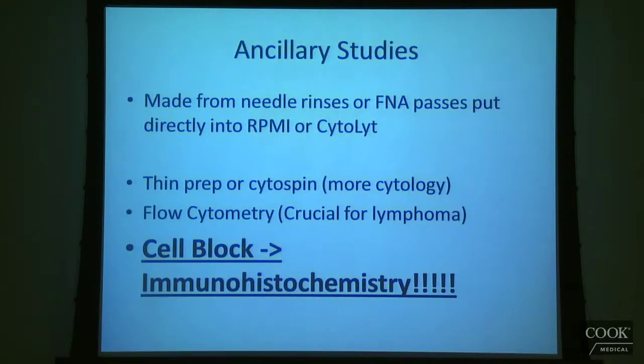In terms of ancillary studies, which are becoming, I guess before there really weren't very many ancillary studies that you could do. Now there are increasing amounts of different studies you could do with material that you don't use to make slides. So basically, prior to ProCore, what we would use for ancillary studies is that the GI docs would do a fine needle aspiration of the pancreas, and instead of making slides, they would just squirt all the material into solution, and we could take that back to the lab with us.